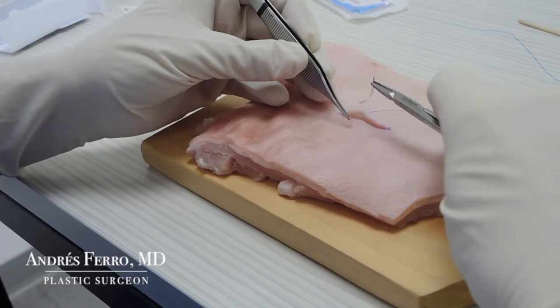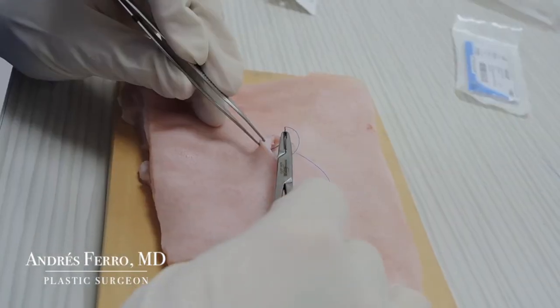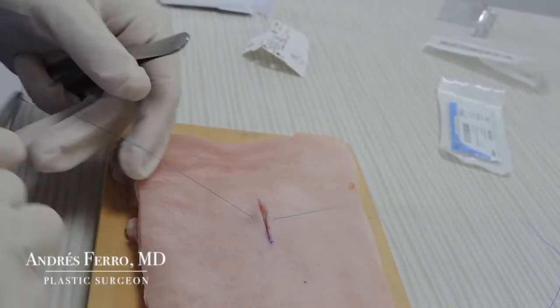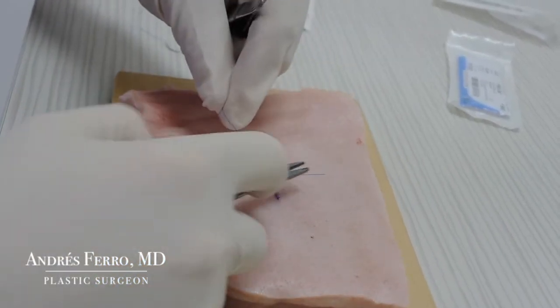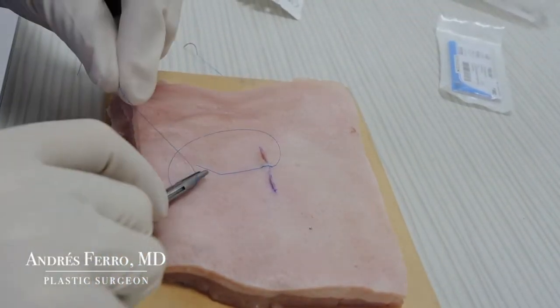Retrieve the needle and now grab the opposite side of the wound, which is in a lower position. Evert and present the wound's edge. Insert the needle deeper through the subcutaneous fatty tissue and retrieve the needle. Perform the knotting of the suture, beginning with a double loop and then continuing with simple loops until finishing the knot and leveling the wound's height.